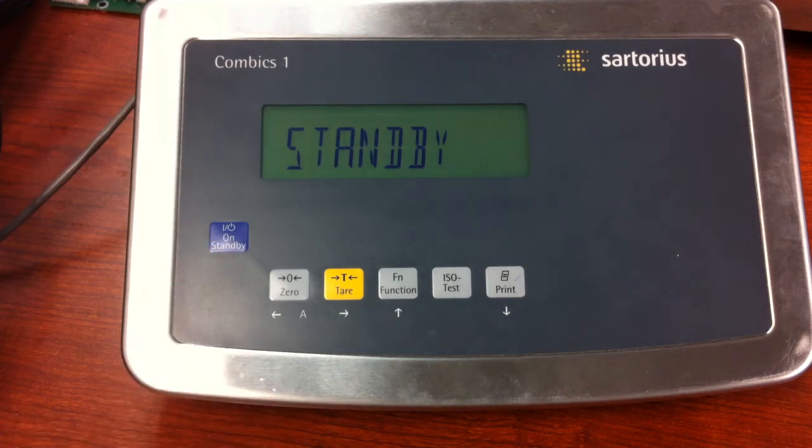This video deals with clearing a password. If you go through your Combics menu and input a number in the password screen, and the unit does not already have a password stored, it will store that as your password. It may happen so quickly you might not be aware of it. There is a way to clear it out and I'm going to show you how to do that.